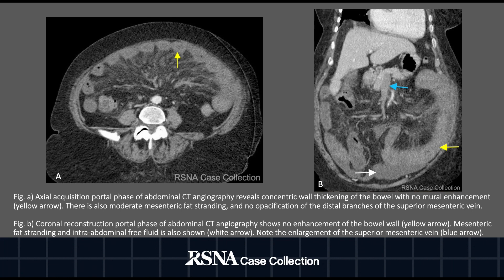An axial acquisition of the portal phase reveals concentric wall thickening of the bowel with no mural enhancement. There is also moderate mesenteric fat stranding with no opacification of the distal branches of the superior mesenteric vein. A coronal reconstruction shows non-enhancement of the bowel wall, mesenteric fat stranding, intra-abdominal free fluid, and enlargement of the superior mesenteric vein.